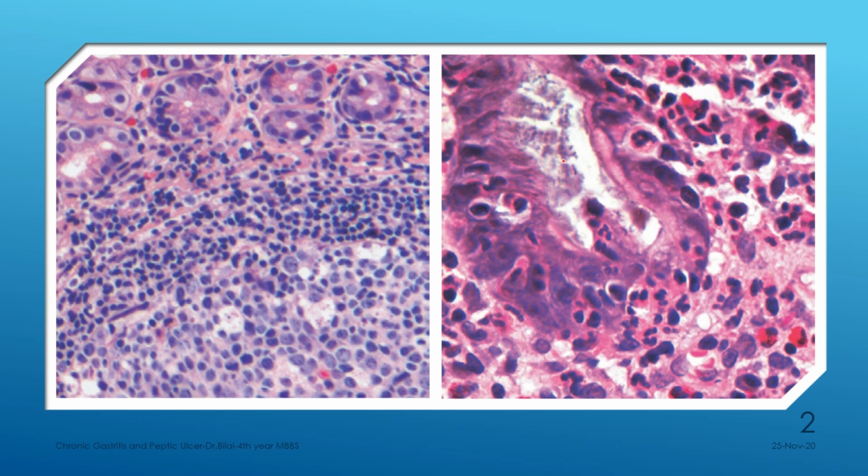This is the surface mucus, and here you see some tiny organisms lying. So these may be H. pylori, and the other associated findings in this lesion, you might say it's not exactly a lesion, it's inflammation, are inflammatory cells that are invading into the surface epithelium. So this here is the surface epithelium. You can see this is the mucus, here are the organisms, and here you can see inflammatory cells that are invading into the surface epithelium.